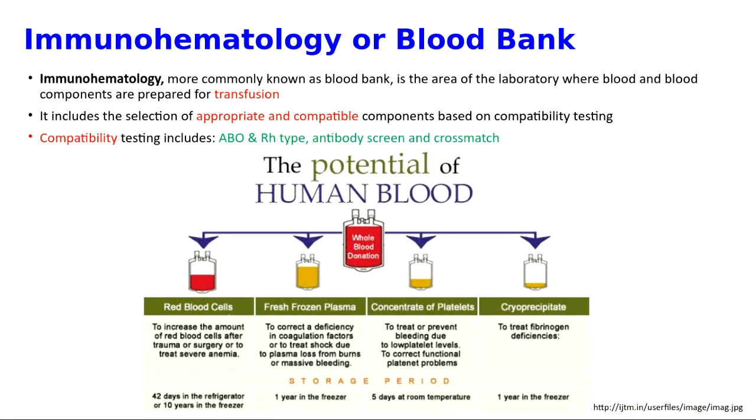I'll mention more about the testing that is done on each unit. And then out of that fresh frozen plasma, they are also going to remove the platelets. There's a minimal amount of platelets, but they are enough so that if a patient, let's say a patient receiving chemotherapy, or taking some medicine that destroys their platelets, needs those platelets to prevent bleeding, then they can pool 5 or 6 bags and give the patient a good amount of platelets to help with bleeding problems.